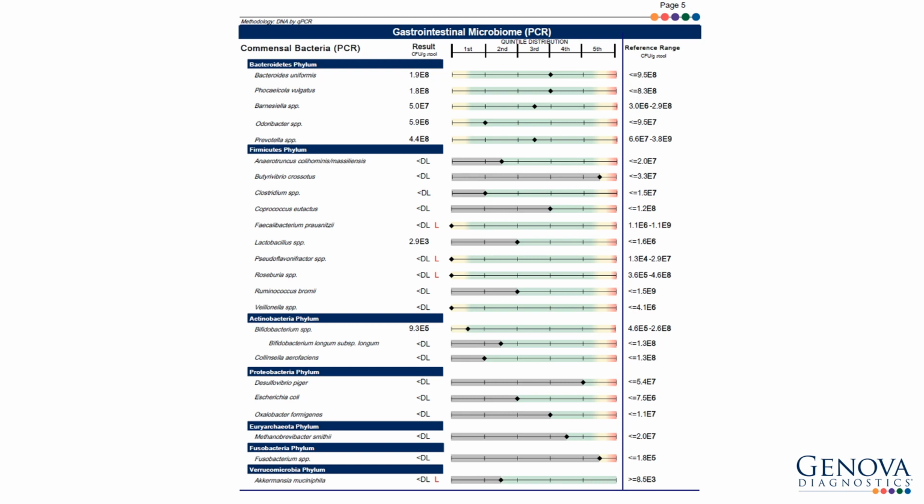It's not uncommon to see H's and L's, or highs and lows, on this page, as every patient is going to be unique with regards to their microbial fingerprint. We do have a commensal bacteria chart that you can download from our website that lists each organism and dietary or lifestyle associations when the finding is high or low.